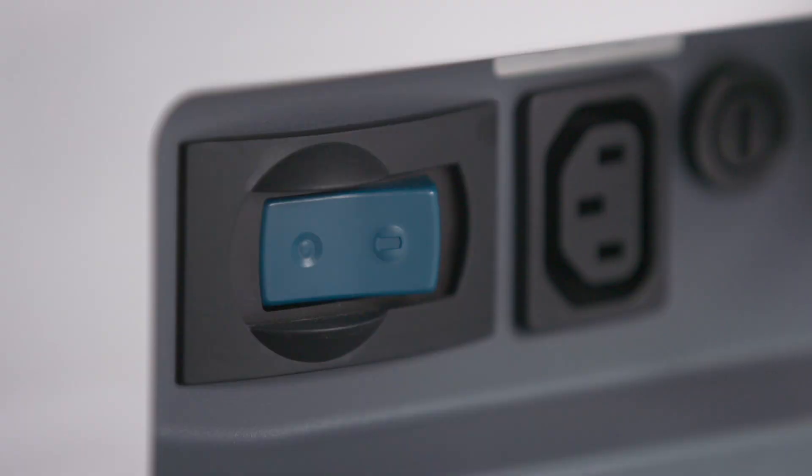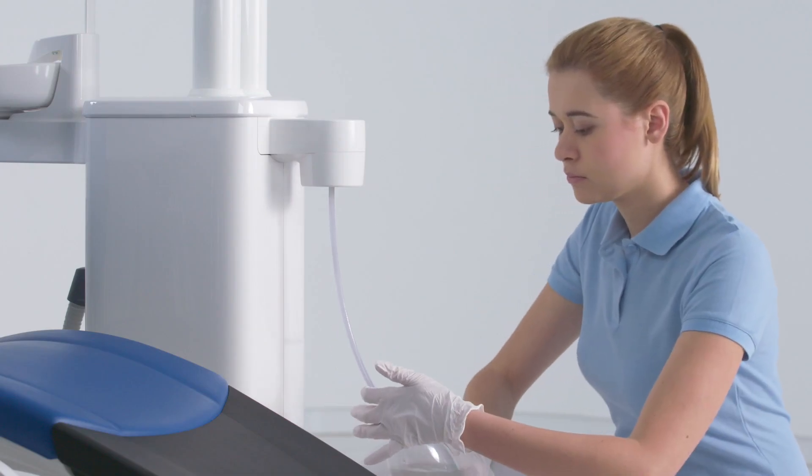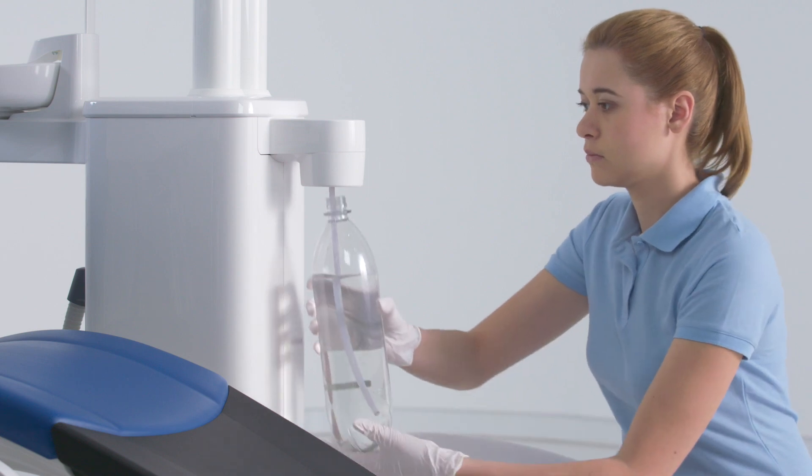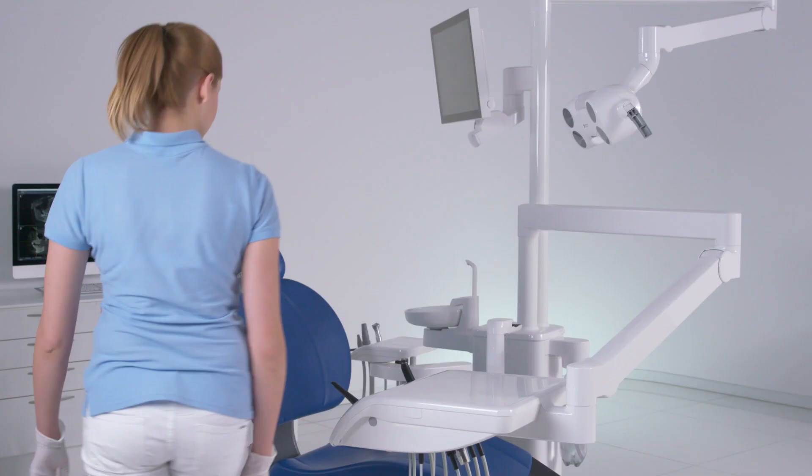Switch your treatment center on at the power switch at the start of the working day. Fill the fresh water bottle with a mixture of water and Dentosept S at a ratio of 100 to 1.